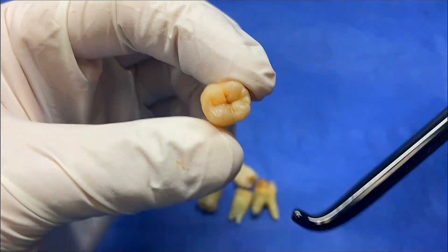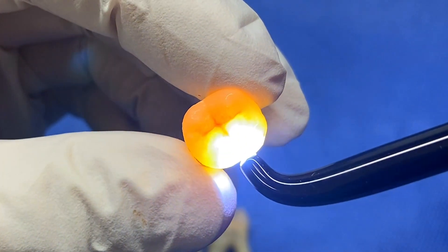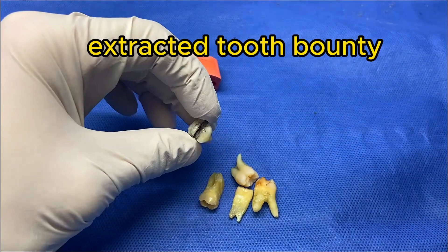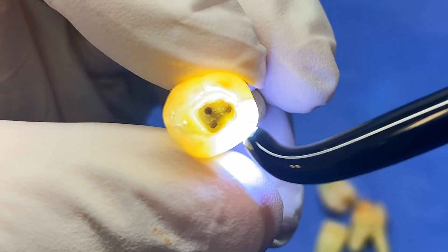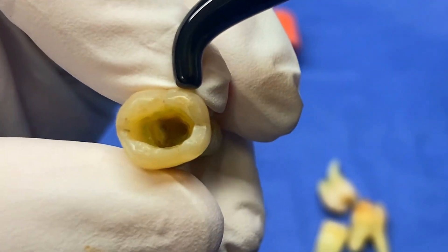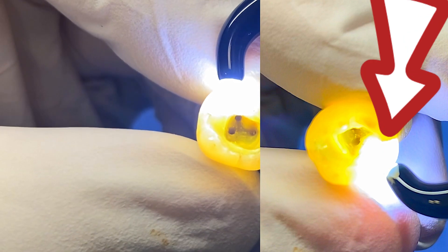Now, this is a non-restored extracted molar. And when we look for cracks, we're looking for something that stops the light directly. Let's go ahead and take a look at an example of where there is a crack. You can see here when I shine the light into this tooth — and this is really for diagnosis to determine whether or not a tooth can be restored.